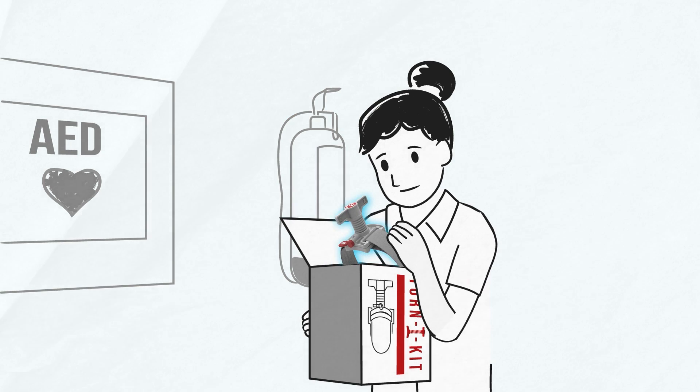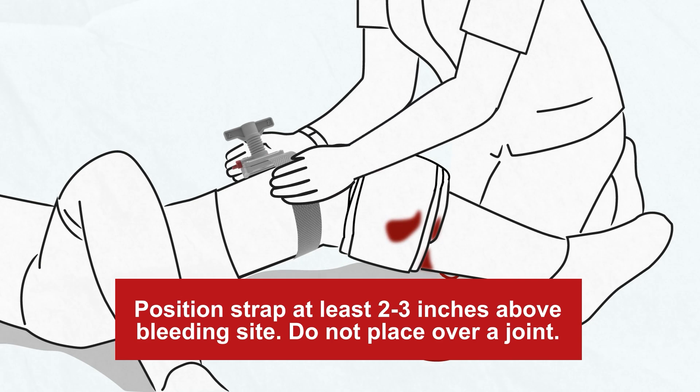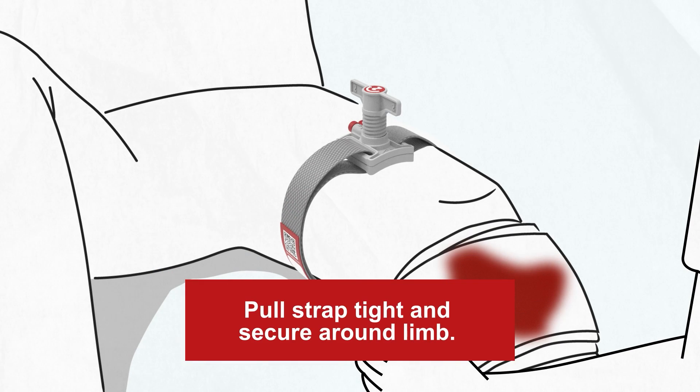Step 1. Fasten the wide Velcro strap tightly around the extremity at least 2 to 3 inches above the bleeding site. The strap should be fastened tight enough that your fingers cannot slide between the skin and the strap.